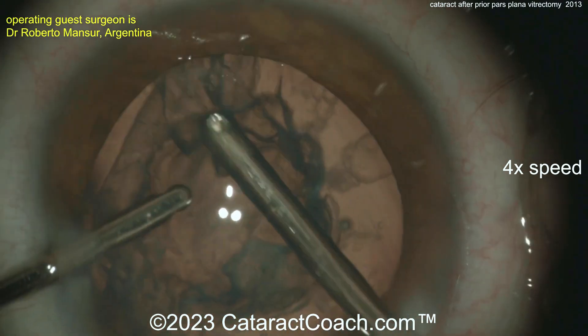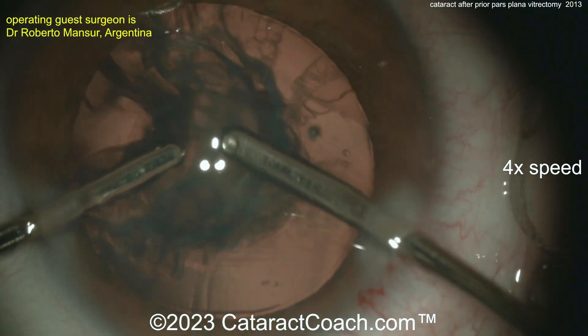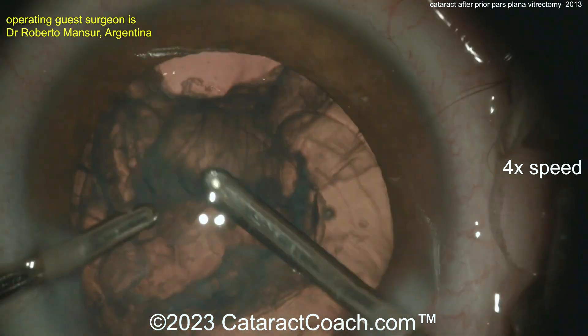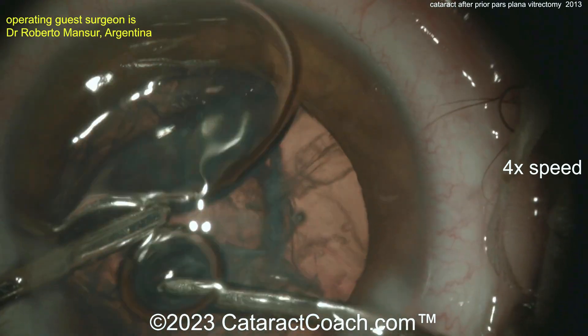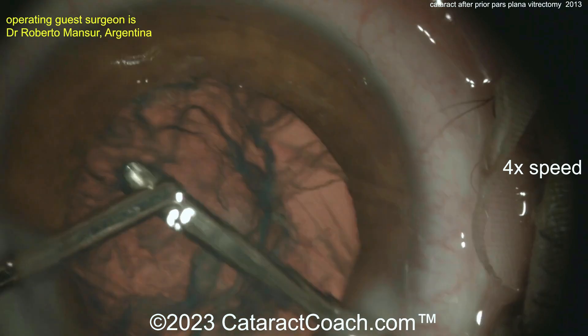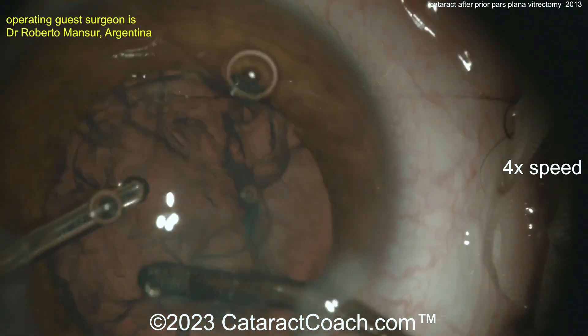Going around — the nice thing with bimanual is you have 360° axis. As you take this out, look carefully at that capsule. Make sure that you're not going to cause a bigger rip there. Trying to free this up, you can also do a visco-dissection. If you've seen any of my videos about posterior polar cataracts, you know the visco-dissection where they disperse the viscoelastic is my preferred technique here.